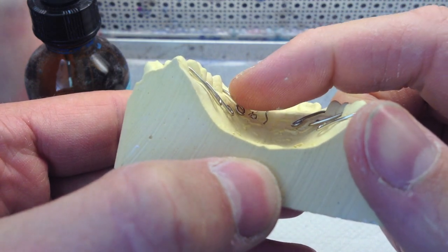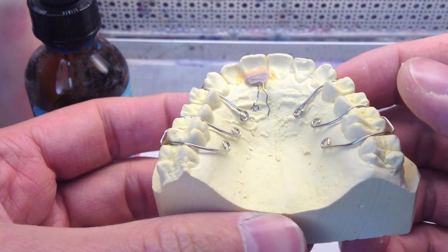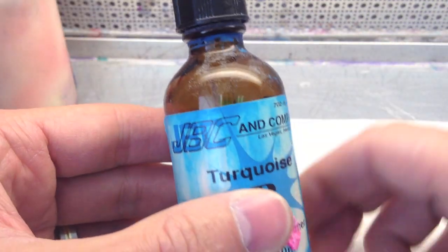The wires are all half a millimeter off of the pallet. My wire bender guy is pretty good. And I'll be using JBC's turquoise.